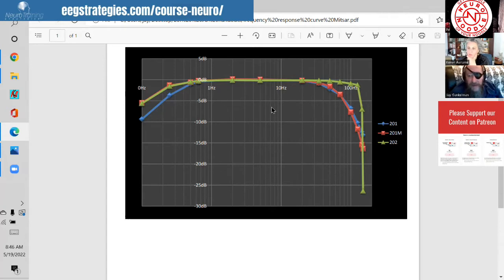If the software and amplifier are intended to acquire the signal and then process it as a cue, without the EEG being the diagnostic piece of that, then it's not a diagnostic device. It's a neurofeedback device, but it's not intended for diagnosis. Again, there's three levels of FDA: medical EEG amplifier, a neurofeedback amplifier, and a general health and wellness amplifier. There's three separate classifications.